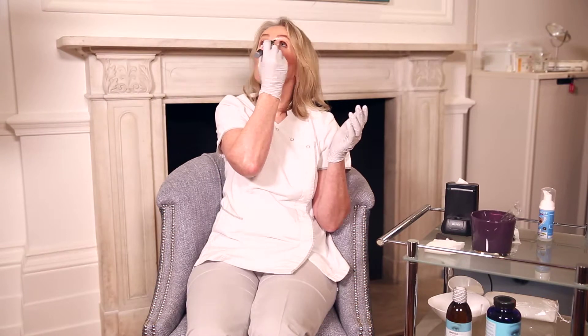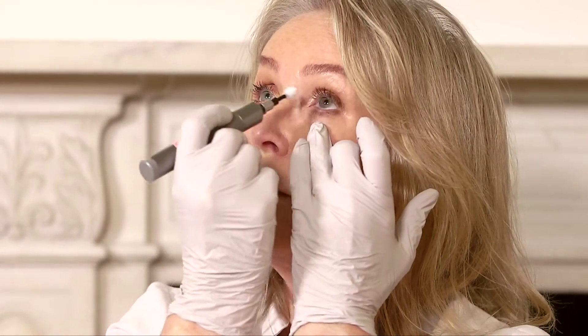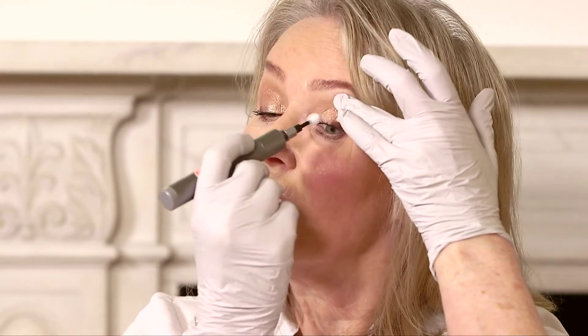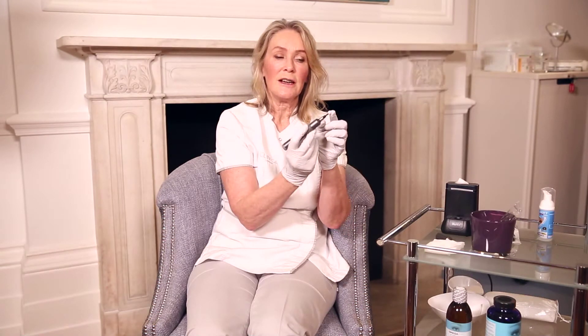The patient is sitting in the treatment chair, and then that goes up on the eyelid. I hold the lid down like that, and I go along the lid margin, and then along the upper lid margin, and repeat. That lifts off with this detergent-y, soft soapy stuff, which doesn't sting.